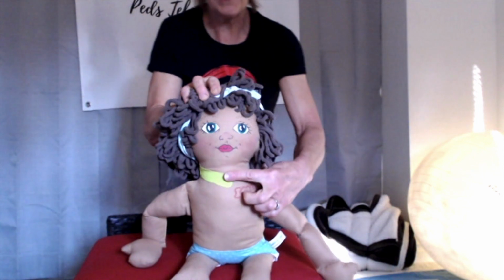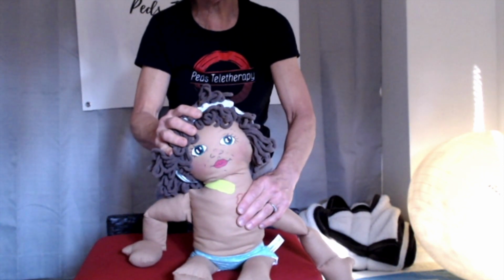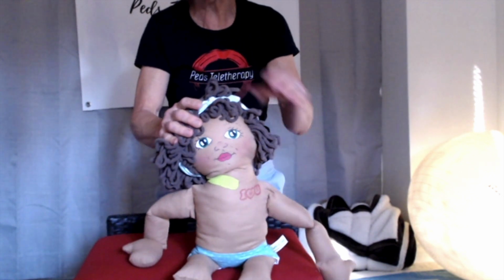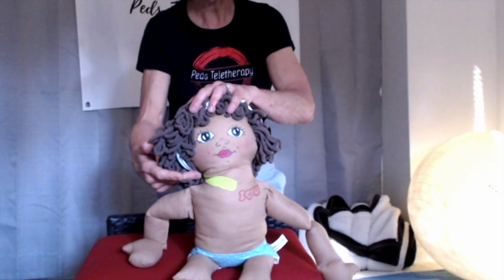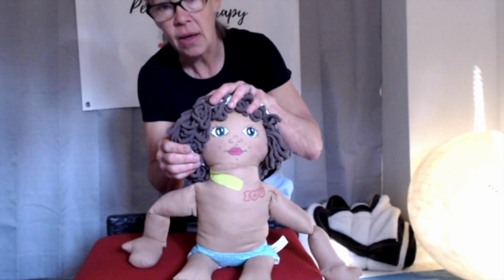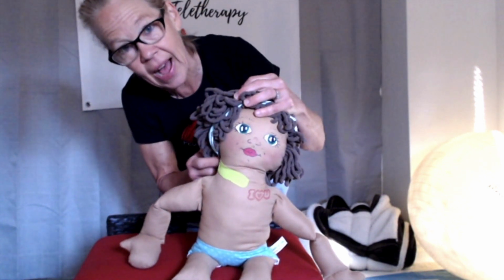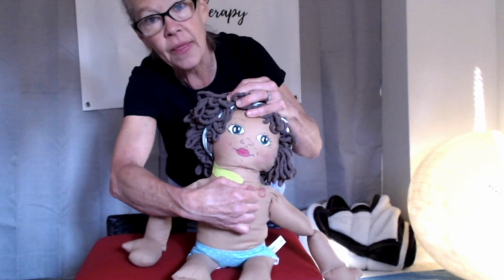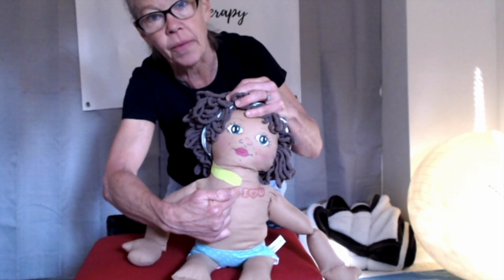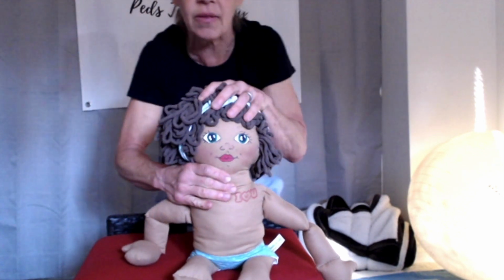You can see I started my, well, I shouldn't say I started. I looked at, she's tight here, right-sided torticollis. I want to loosen this muscle, get this muscle to relax. So I want to inhibit it. So what I did on her is I started it at the insertion for I, inhibit, and I taped downward in that direction towards her origin. Only put one piece on right now. I'll show you the other piece on the other side in a second.